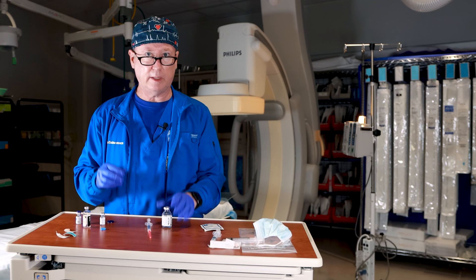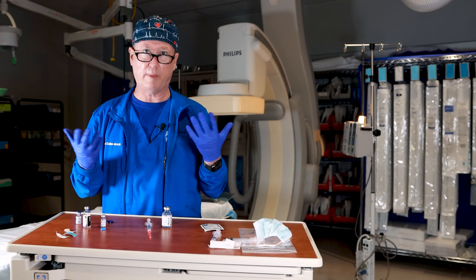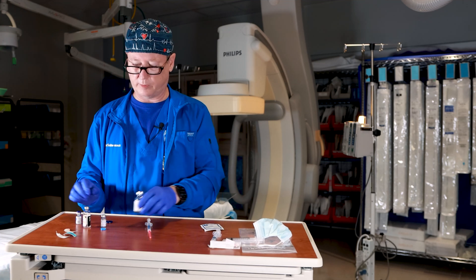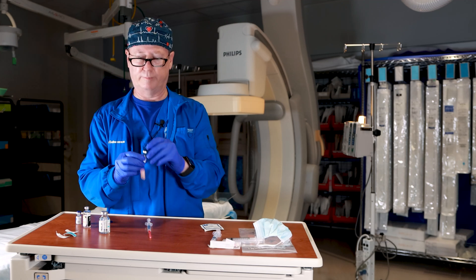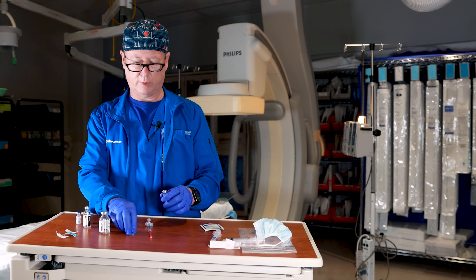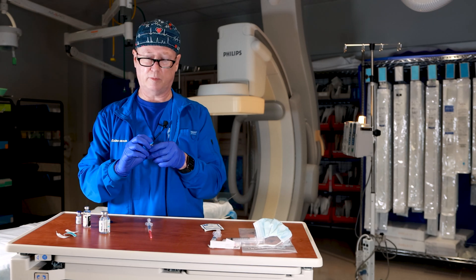You should wear gloves when you're handling medications, and you should have a mask on in the cath lab — I don't have one on for talking purposes. The medications come with a cap on them. The cap's already been popped off because we've already used this medication.